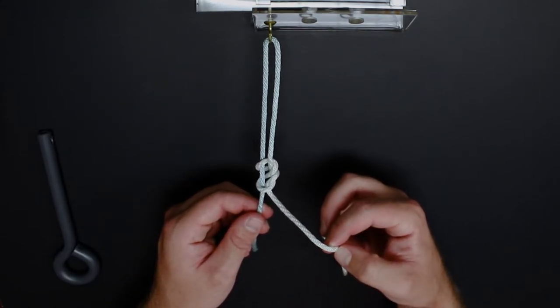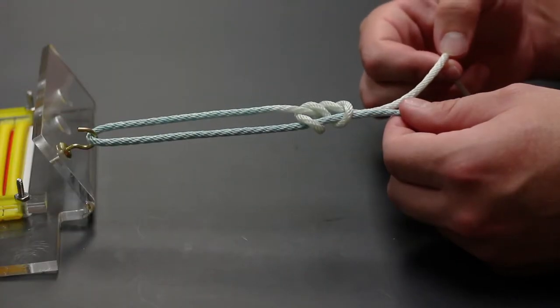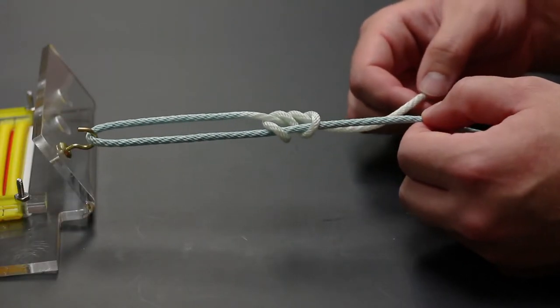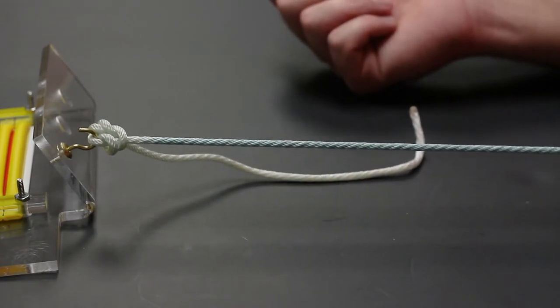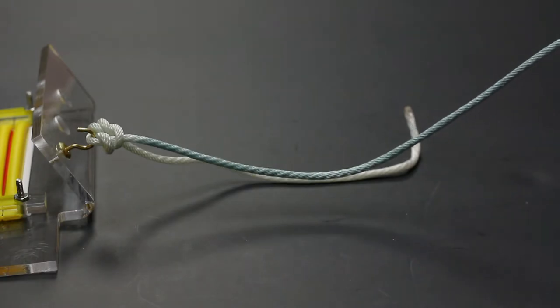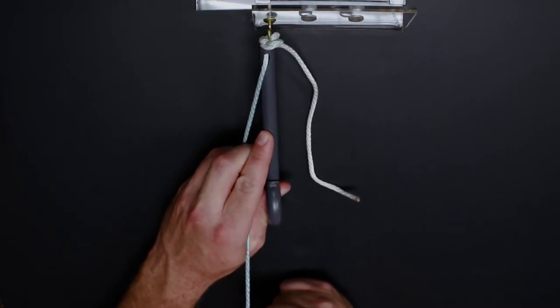In this instance, we do not want to pull on the loop limb as this will cause our knot to lock, and then we will no longer be able to push it against the tissue. We can then pull on the post, and this will tighten the knot. We can then further push the knot against the tissue using our knot pusher.